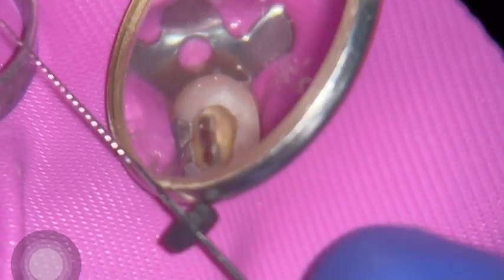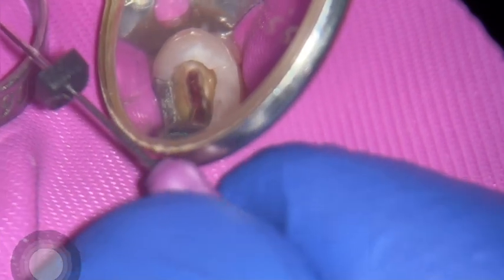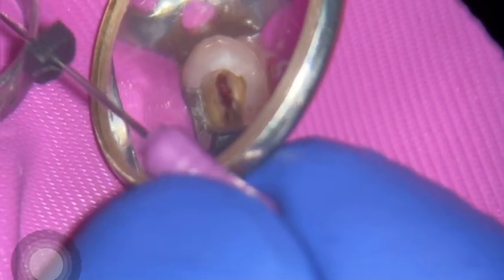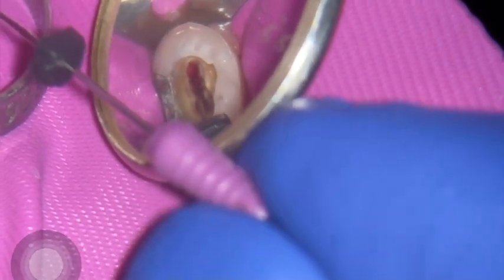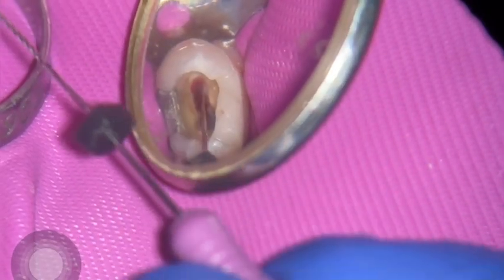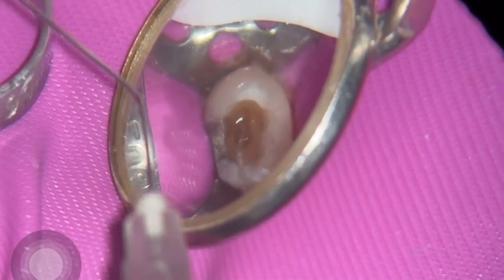I'm just going to let it play live so you get to see how long I spent searching for the canal. Don't worry too much about extra canals when you start root canal treatment because you can always come back. I find it easier sometimes to just prepare the canals that I know are there — the buccal and the palatal in this case — and then return later to see what I have. So far nothing here. I'm going from the buccal, slightly moving to the middle, then to the palatal, trying to find anything between them.